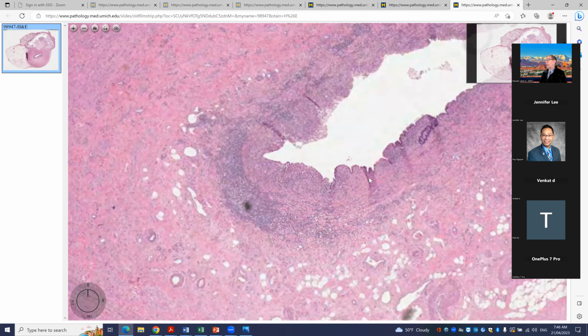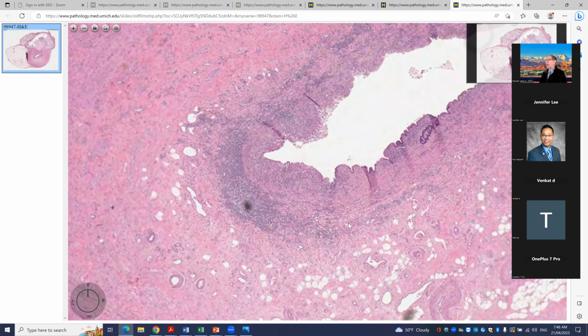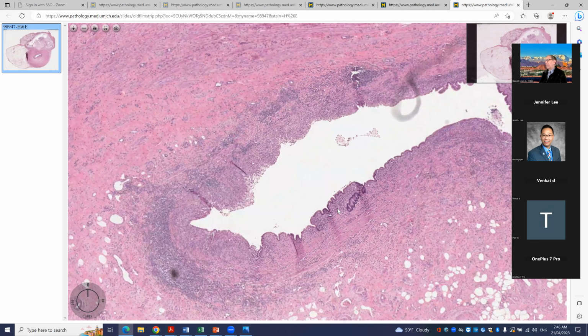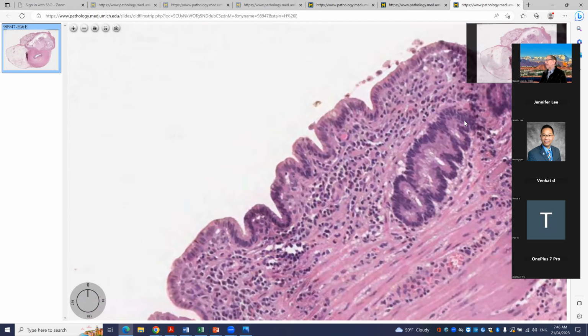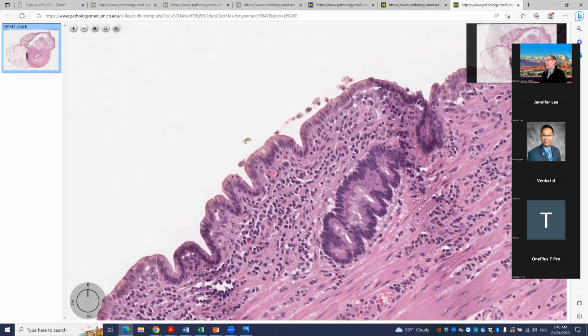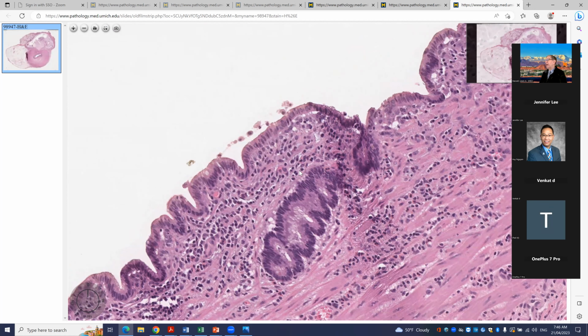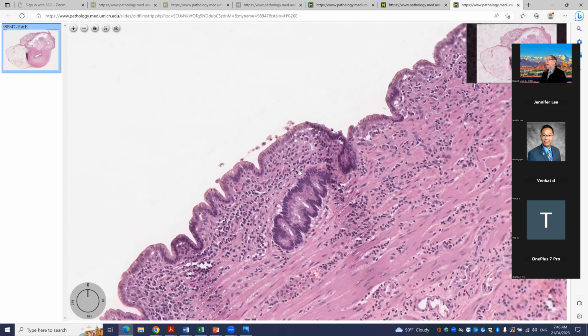Now, the question is, could we qualify any of this epithelium as dysplasia? I had a hard time with that. I do not think that I could truly say for sure that this is dysplastic. This gland here is a little bit more hyperchromatic, and so you might wonder about this as being dysplastic. But I would really want to see more clear-cut evidence of dysplasia and would section this much more thoroughly to make that determination.